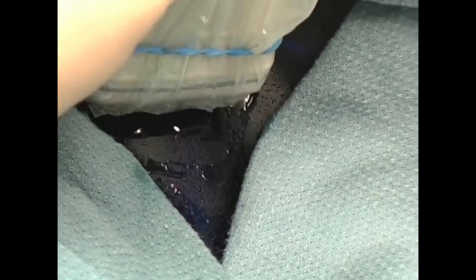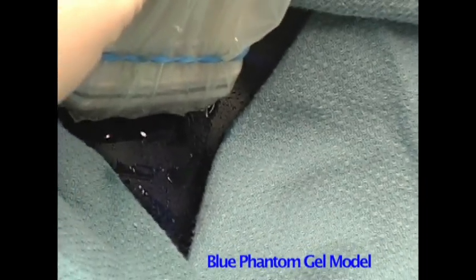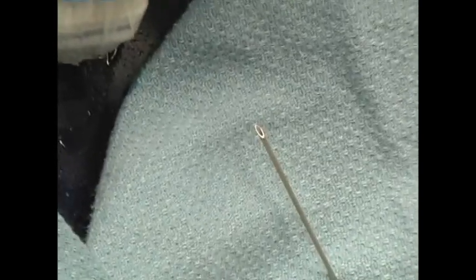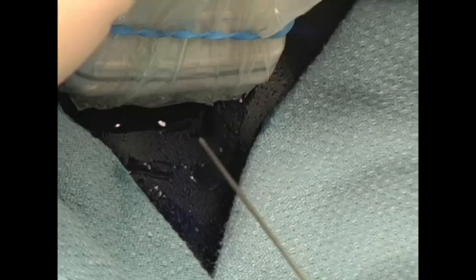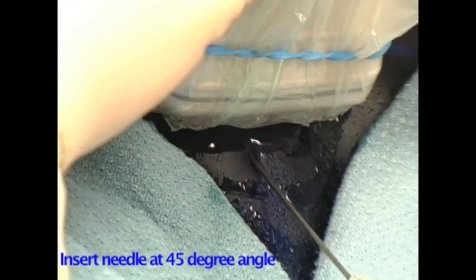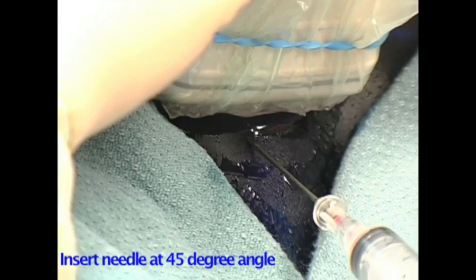Now that the skin and the subcutaneous tissue are anesthetized, we're ready to proceed with actual cannulation of the vein. With the vein directly in the center of the transducer, the needle is inserted along the same path as our anesthetic with the bevel pointed inferiorly. It's inserted approximately 1 centimeter above the transducer. The transducer is angled towards the needle tip so that it's visualized just after it enters the skin.